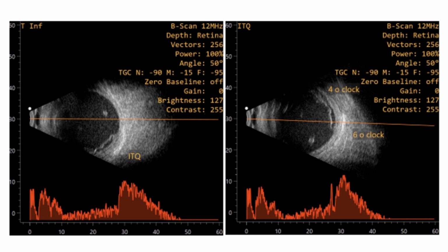In this ultrasound, you have to give a differential diagnosis of a vitreous membrane. Endophthalmitis will have multiple vitreous membranes, and you should also look at the OT notes to see whether PVD was induced, whether any vitreous was left behind, how much vitrectomy was done. Sometimes you will have exudates lying on the retinal surface, which will also appear like this. So it need not be retinal detachment. You have to give various differential diagnoses, and also look at the movement of this, whether there is movement or not. So to call this a retinal detachment at this stage is very difficult.